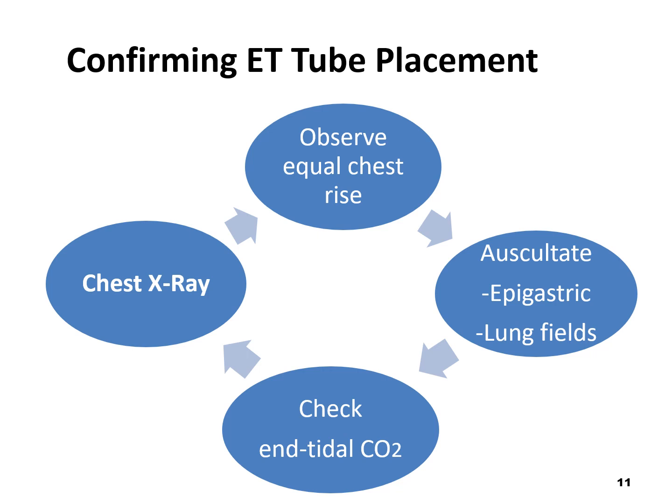However, if you have left side breath sounds, that usually indicates that you are at least above the carina, so that you are ventilating both sides. But you would listen to both sides. You would check the end tidal CO2 to make sure that it is in good placement. Waveform capnography is preferred, but you can use colorimetric.